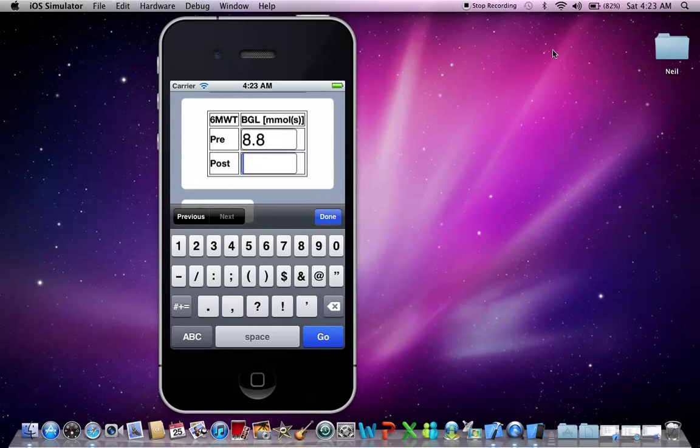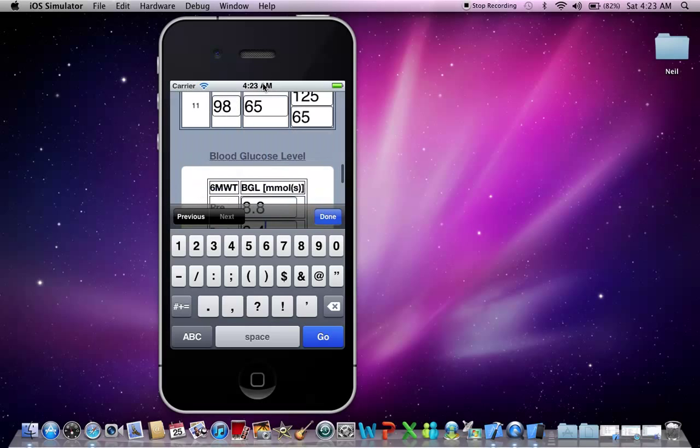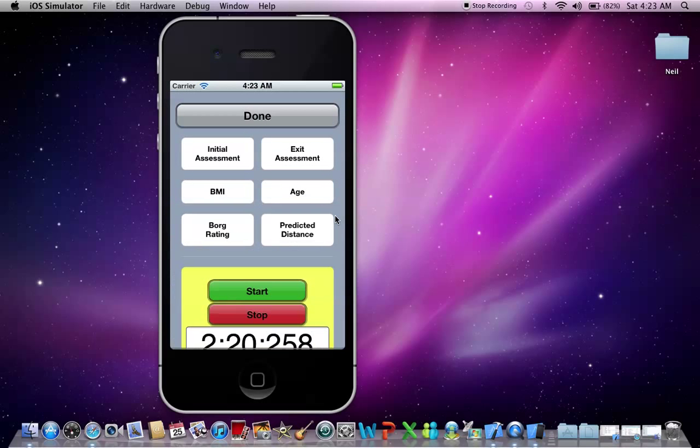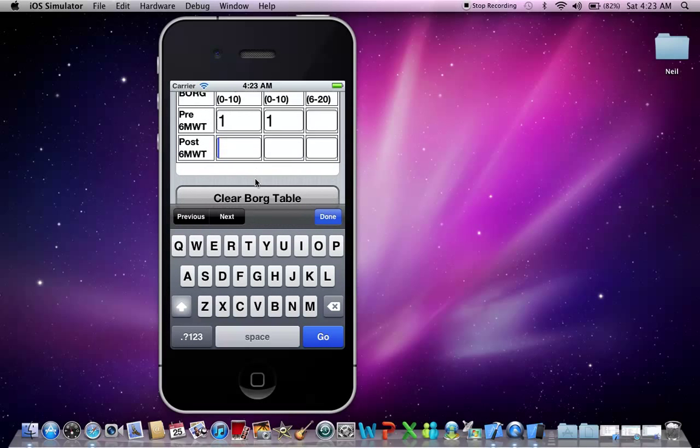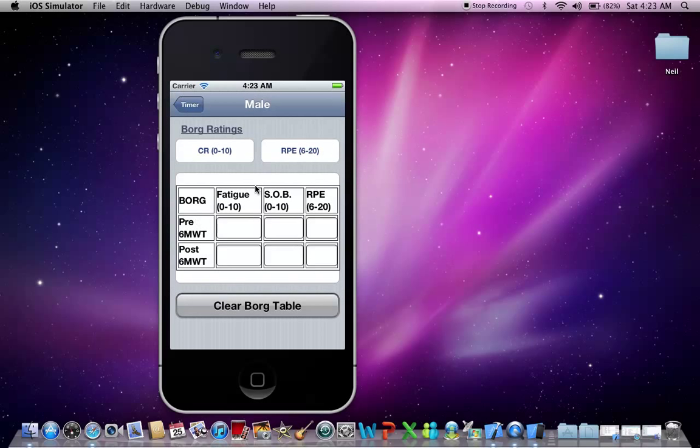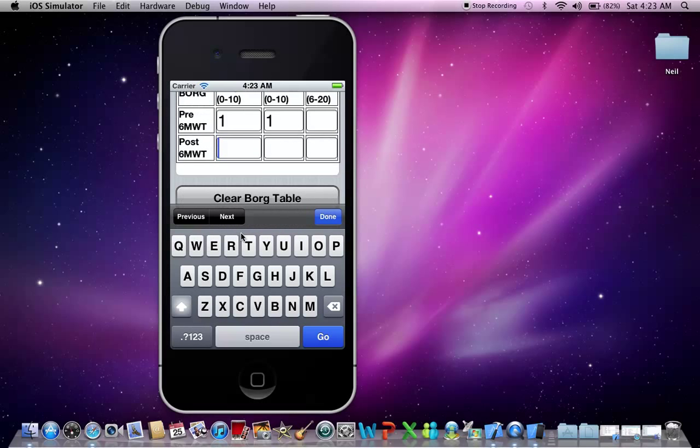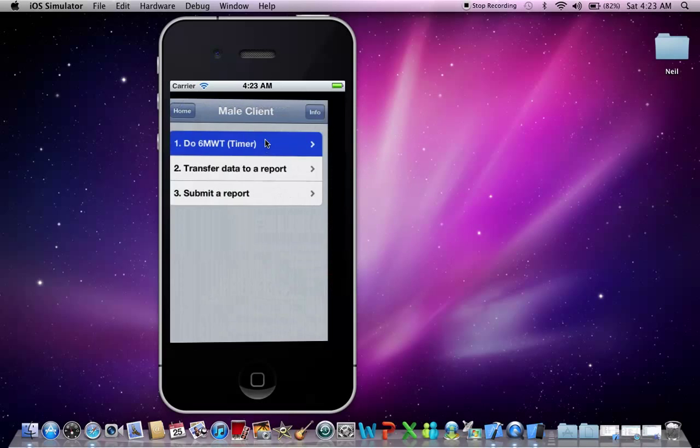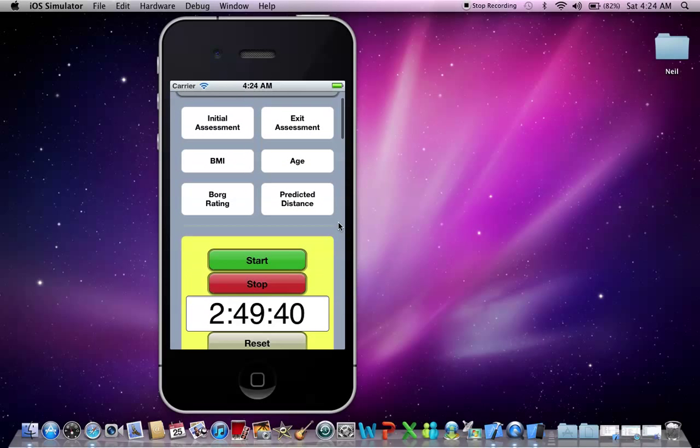Now I'm also going to put in my blood sugar when I take it after the 6 minute walk test. And also, I'll put in Borg scale ratings for after the 6 minute walk test. For example, a 3 for fatigue. I just pressed the clear table button, not to worry I can fill those in, and a 12 for RPE. Let's press done, okay, let's go back, and now we can fill in the rest of the tools here.